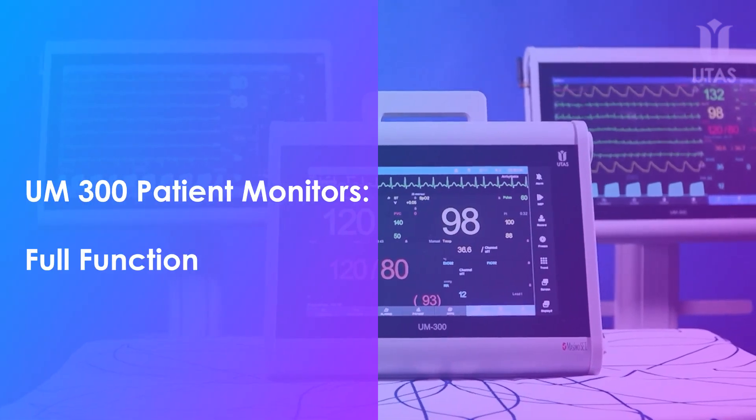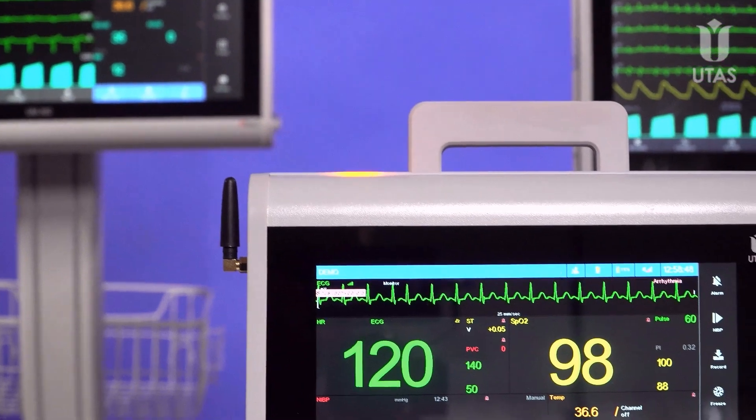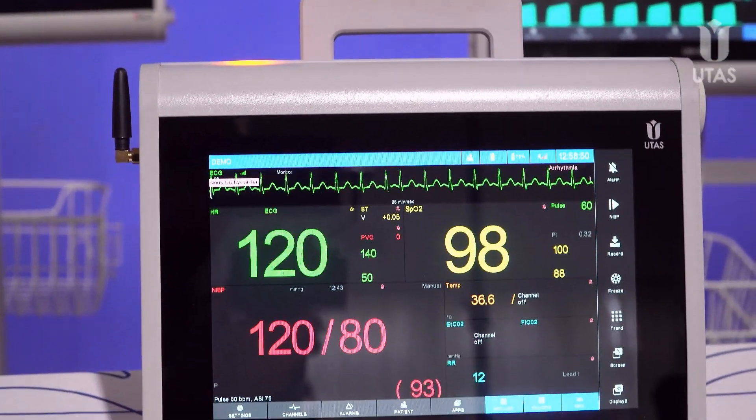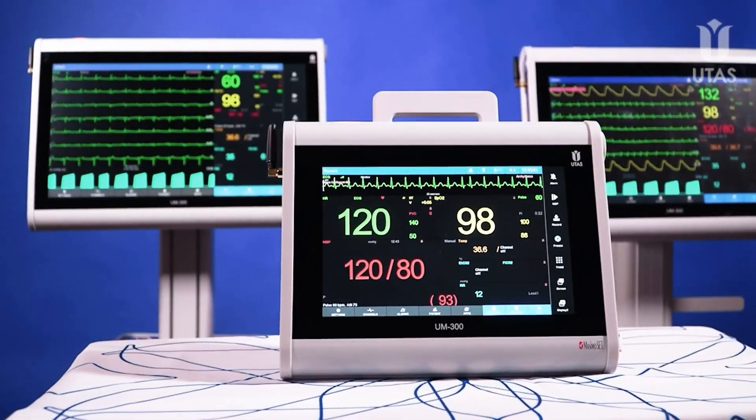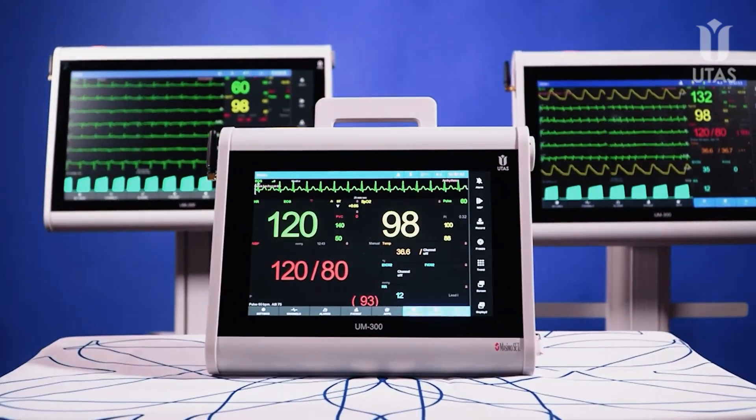UM300 patient monitors offer full functionality regardless of size. Choose the UM300 patient monitor with a 10, 15, or 20 inch display and get full functionality regardless of the model.